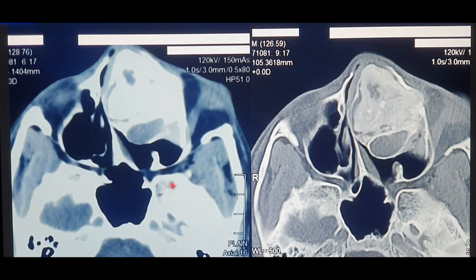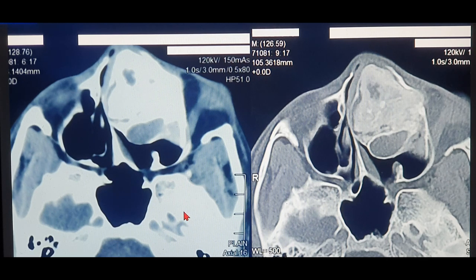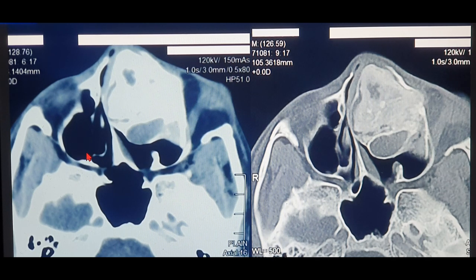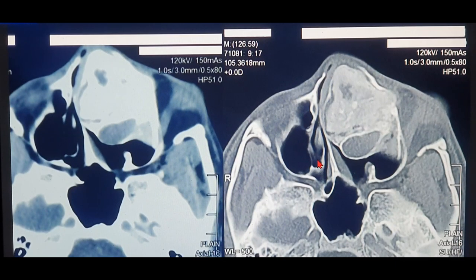Comparing that same scan on a soft tissue window, all that detail disappears. It appears as one uniform hyperintense illuminating bone - you cannot differentiate between the cortical outer and inner table at all. You cannot see any structure; it is just one uniform hyperdense structure. It is very difficult to study bone on a soft tissue scan. Remember: if you see a well-detailed bone picture, it is a bony window; if you see a white uniform hyperdense illuminating bone, it's a soft tissue window.